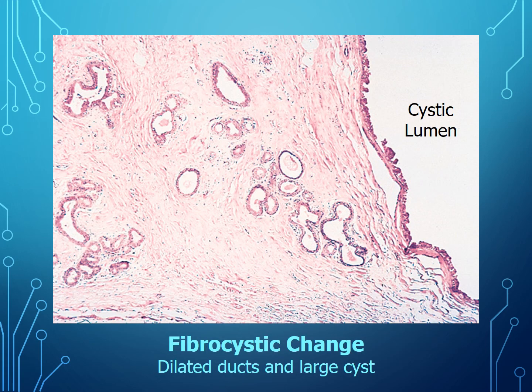Here is the histology of fibrocystic changes. You can see a gigantic dilated duct that has formed a cyst, with an epithelial lining of myoepithelial cells and luminal cells. There are other little dilated ducts present, and all the pink material is fibrosis. This is all fibrocystic change — a non-proliferative lesion of the breast.